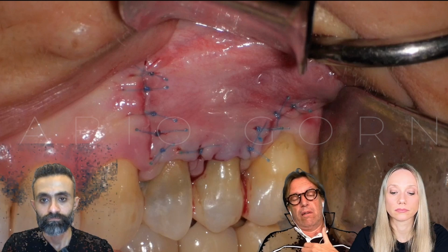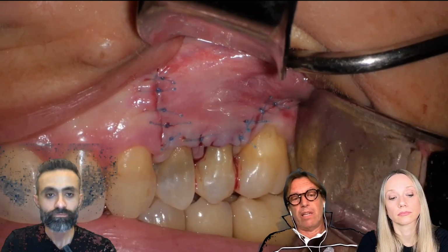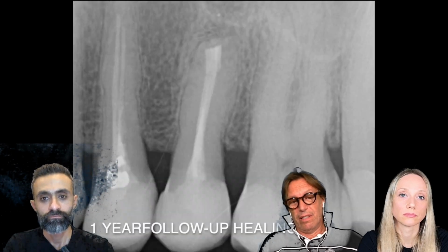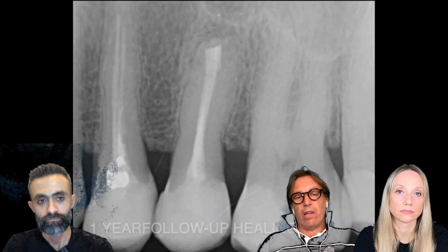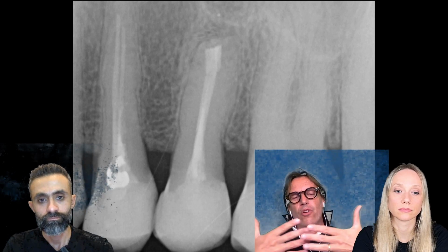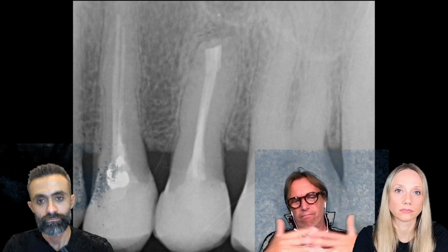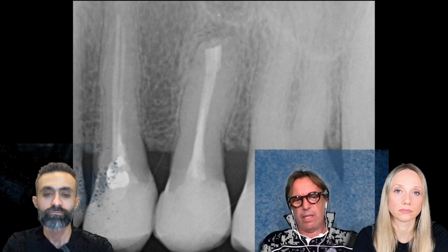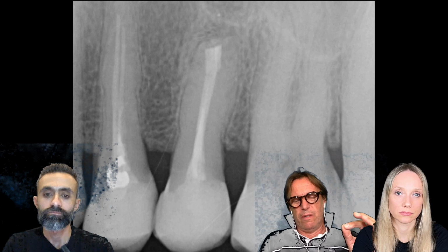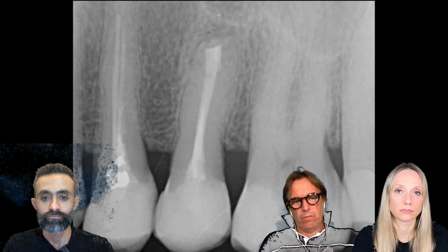The scars, for example, many years ago, we discussed making an incision with a 45 degree bevel to improve the quality of the connection between the two parts of the incision. It's not true. It's important that the incision must be very precise. That's it. After that, no scars at all.